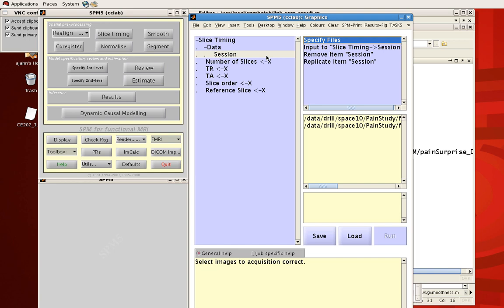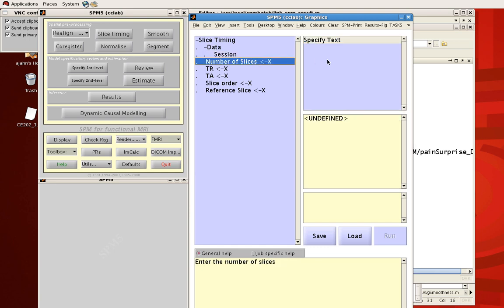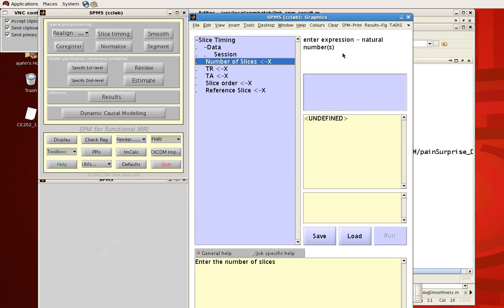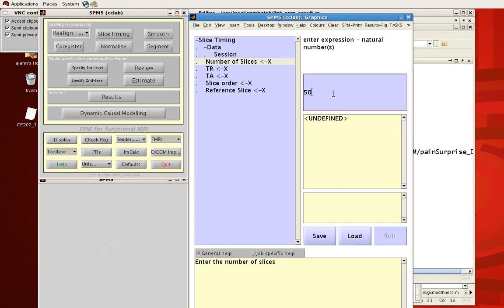You can actually click run after you filled in all these other X's and sometimes you'll see something like specified text where if you click in this pane you will then be prompted to enter in some text. And again usually the help for what you should enter is given down here in this general help box. So for example enter the number of slices, let's say it's 50, just hit enter and notice again that the X is gone.